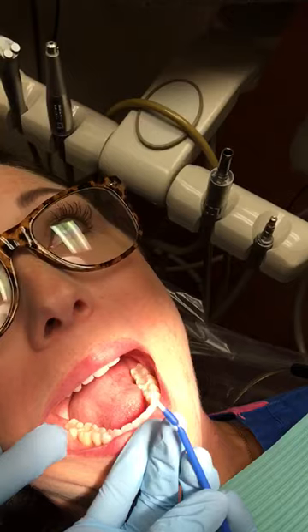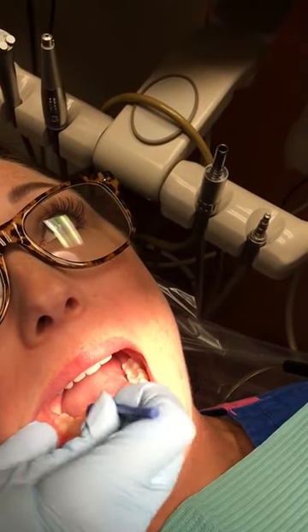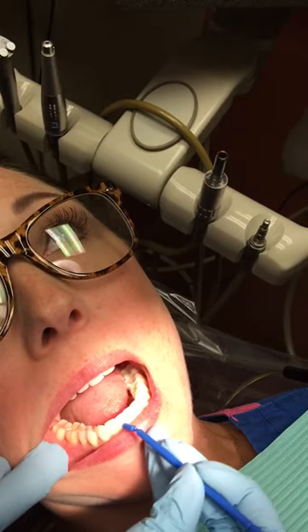Just retract the cheek on one side. Do one swipe across the facials and touch the occlusals.